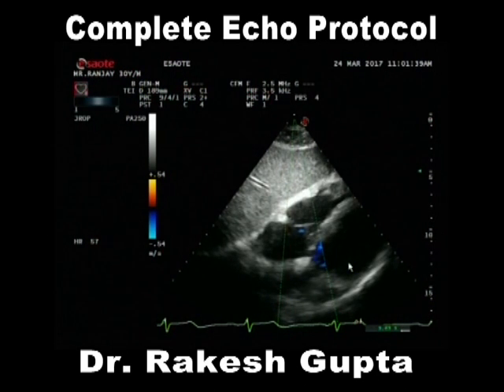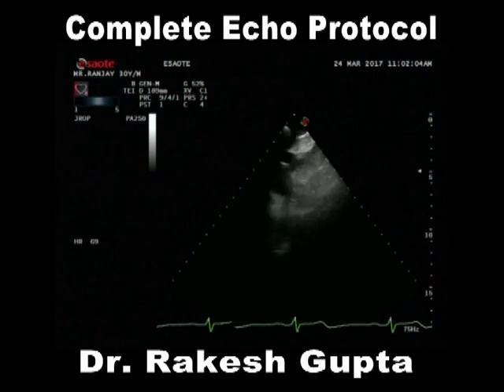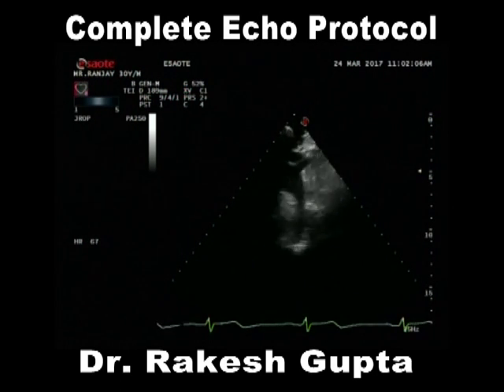Once we have gone through this, we have to go to the ascending aorta and the descending aorta, and what I always suggest is take a bed sheet or a pillow, put it behind the neck of the subject rather than behind his head. When you put it behind the neck, you can extend his neck, and a little on the left-hand side, you can look at it in that particular fashion, looking at the ascending aorta and descending aorta for their functions.